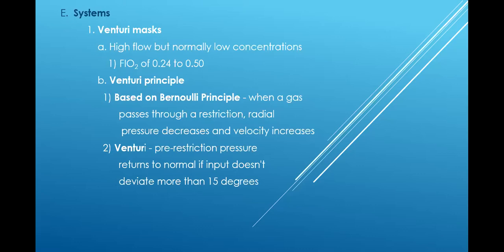Now, it will decrease the FiO2, but it increases the total flow, right? I let the window down, the total flow inside my car, like, damn, let the window down, right? It's a lot of flow, even though the percentage of fart is almost gone, okay? So if I increase the flow, I'm going to decrease the FiO2, okay? If I decrease the flow, I'm going to increase FiO2. Don't forget that, all right?